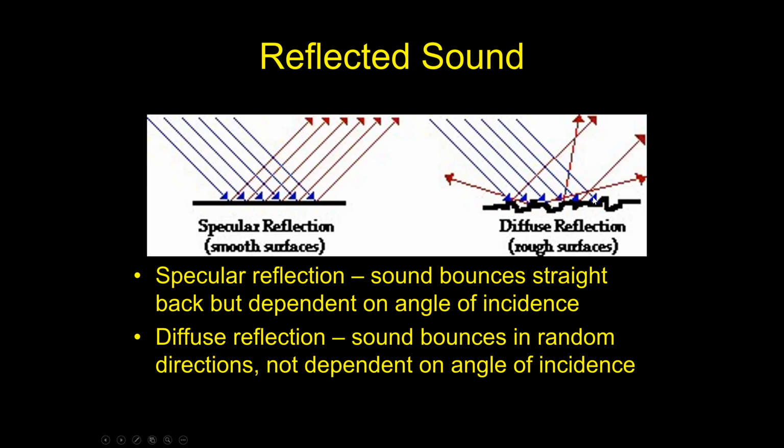So why do we need to know that? Let's take the kidney of a cat, for example. If we have a 2-year-old cat that's normal, the outside part of that kidney, the capsular margin, typically is going to be very smooth and glossy with a kind of white sheen if you would look at it grossly.